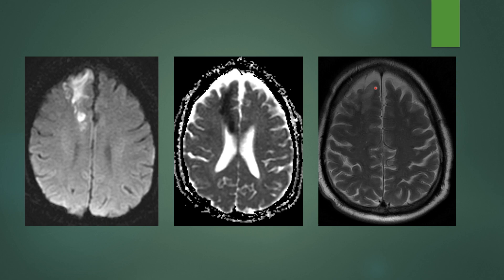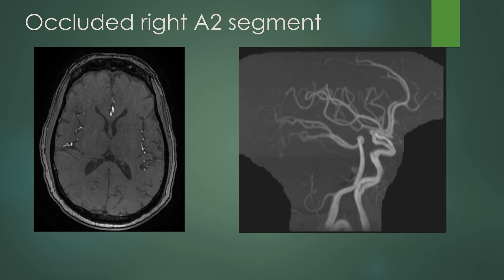This is a right ACA distribution infarct. On vascular imaging — in this case an MRA — you see the paired A2 segments with an abrupt cutoff of the right ACA. On a more lateral view of the MIP images, you can see the left ACA continuing on its arch around the corpus callosum and abrupt termination of the right A2 segment.